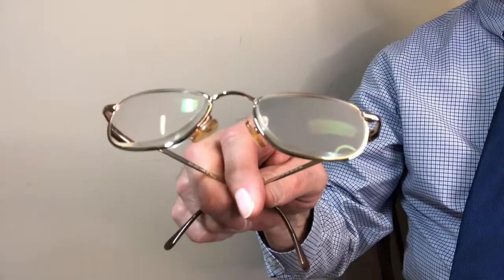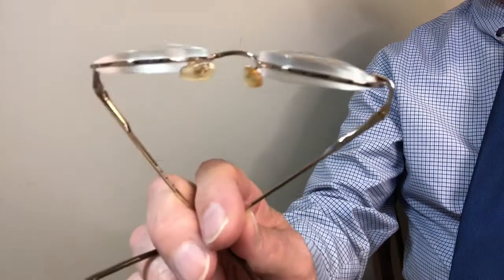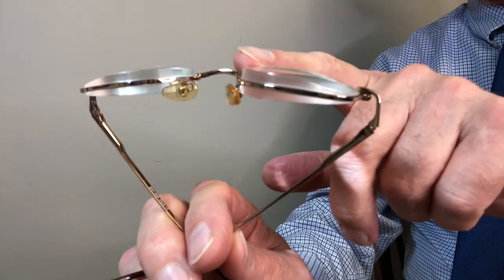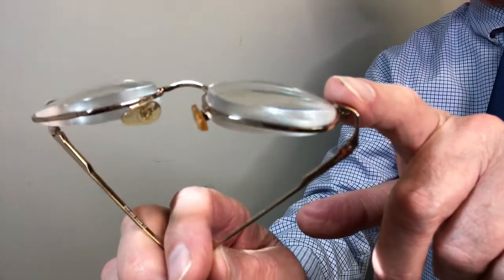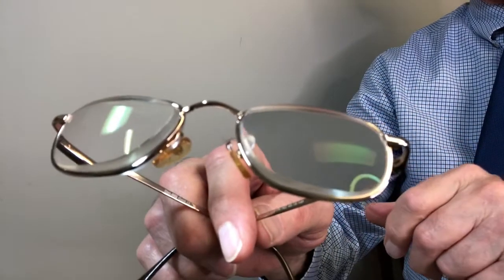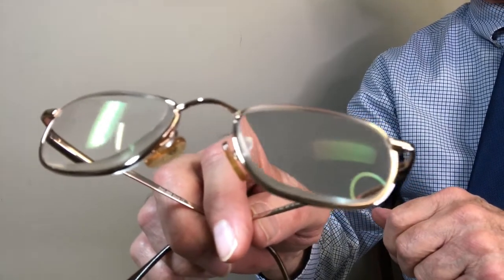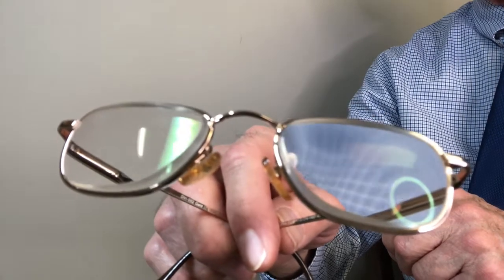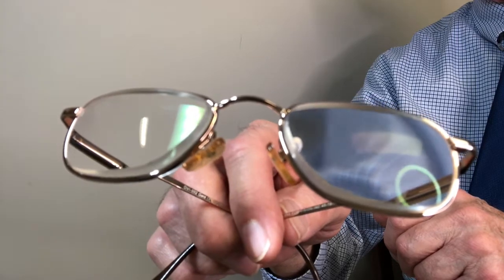Prismatic glasses are used for reading or other close tasks. This prismatic feature, as you can see, the lens is thicker nasally than it is temporally, allows the two eyes to work together at a very short distance. This particular pair focuses about 8 inches from the person's face, and for many people, prismatic glasses are just exactly what they need for close vision.